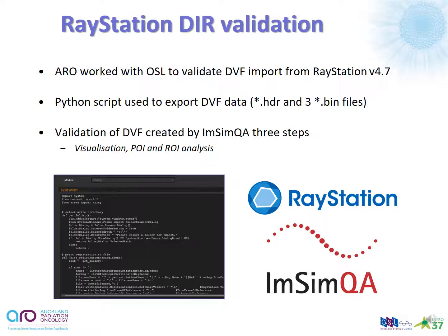Now we performed a validation of this import into ImSimQA in 3 main steps, covering visualization of deformation vector field, POI analysis, and ROI analysis. And I'll go through each of these in turn with the system.